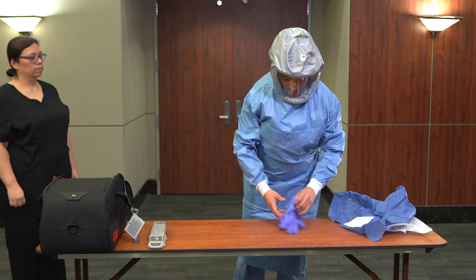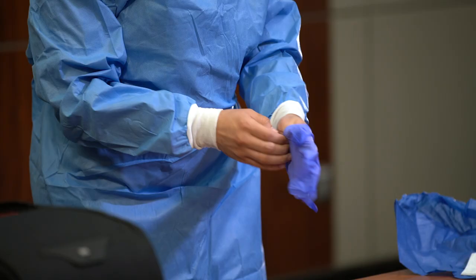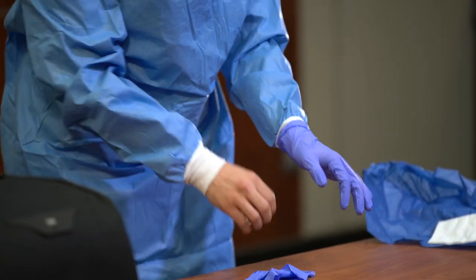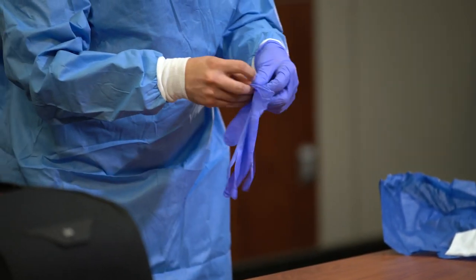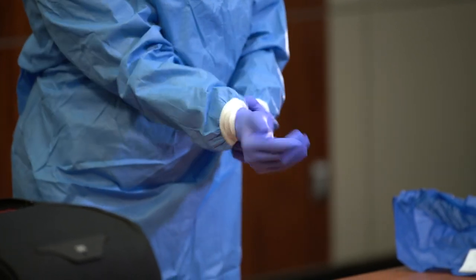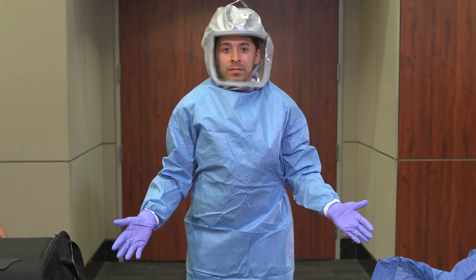Don gloves. Gloves should not be too tight or too loose. Tight gloves could potentially tear, and loose gloves will hinder your ability to perform certain patient care tasks and may come loose. Ensure that the cuff of the glove is over the cuff of the gown. You may now enter the patient's room or patient care area. Transmission-based precautions must be applied in conjunction with standard precautions.